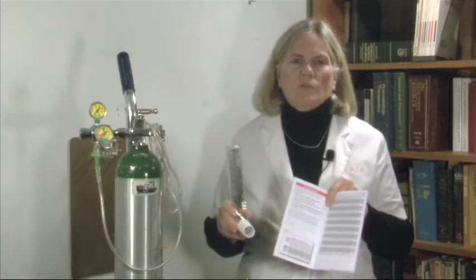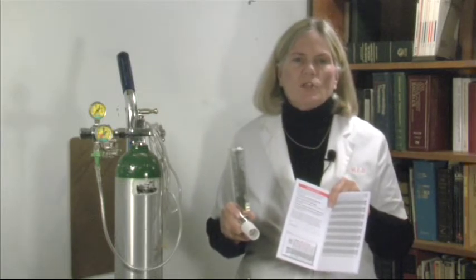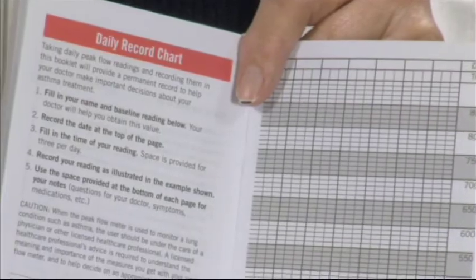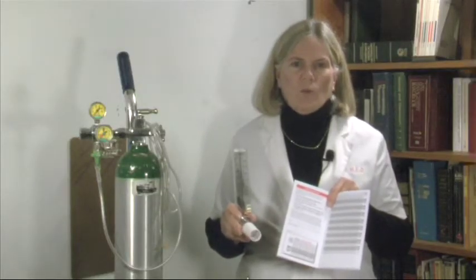Your doctor would be the one to show you how to use this, and they would show you where and how to chart with your name, the date, and the initial baseline. It is also based on your gender, how tall you are, and how old you are.